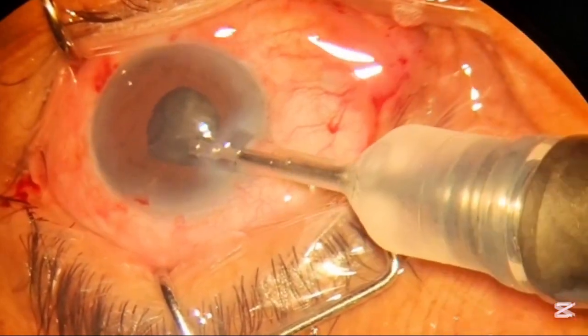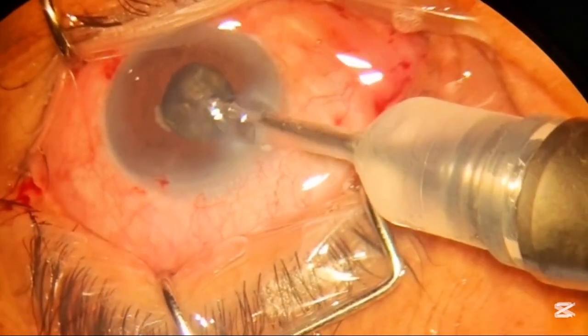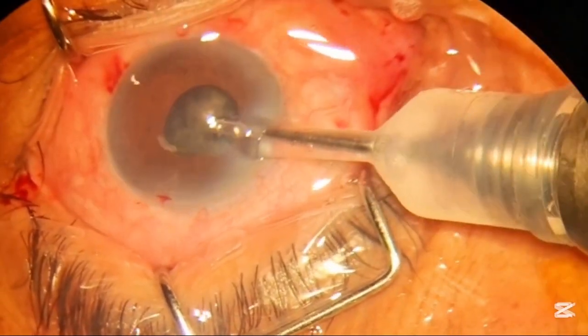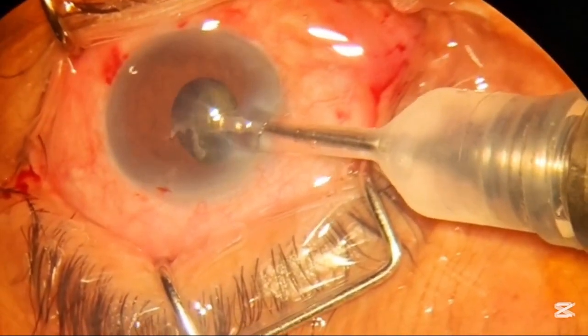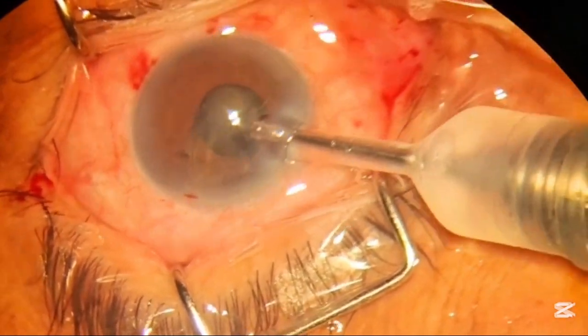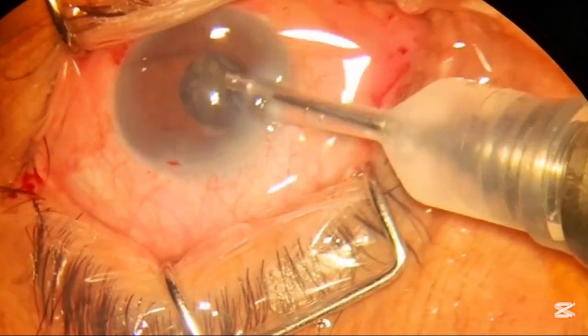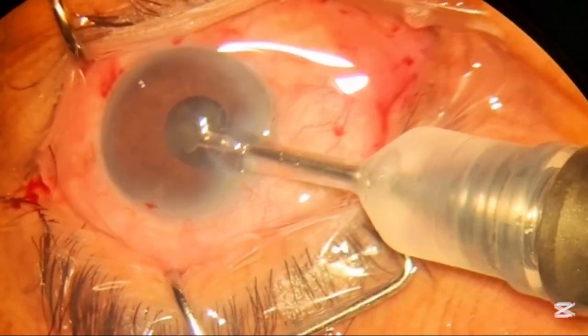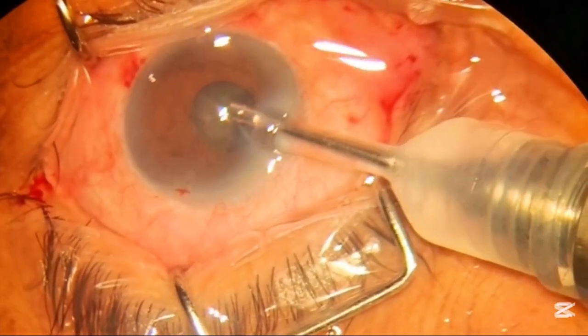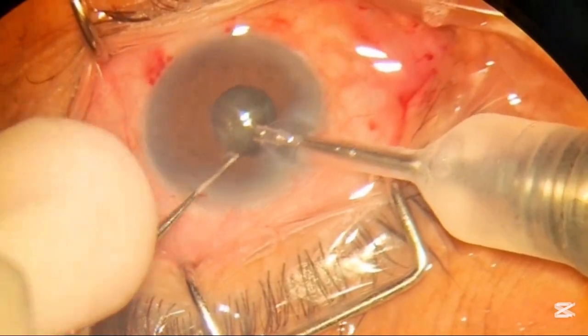After controlling the situation with the pedal, you can easily remove the nuclear material. Always remember that your tip should be in the center of the pupil to achieve maximum distribution of fluid and thorough fluid circulation in the anterior and posterior chamber to remove the contents safely.